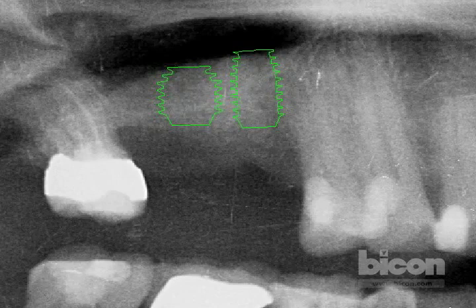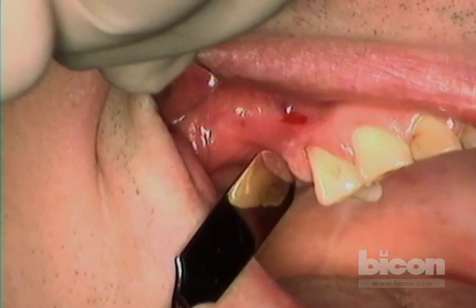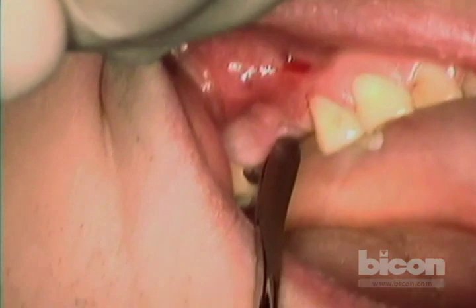Our plan is to perform a small internal sinus lift. The real challenge is in the more posterior area where the bone is between two and three millimeters at its widest in the most mesial part, and the crest is actually narrow clinically. The plan is to perform a floor transport sinus lift, taking advantage of the narrowness of the crest, and placing the sinus lift at the same time as the implant.